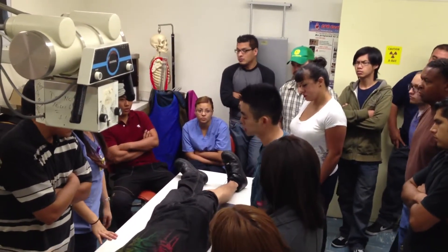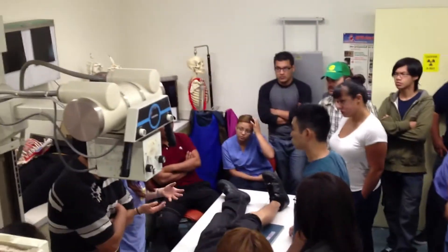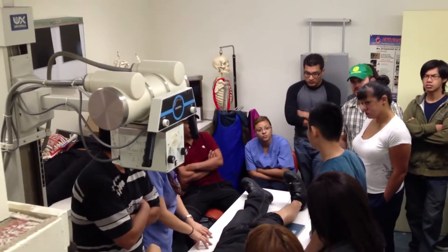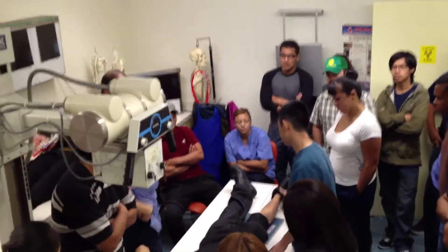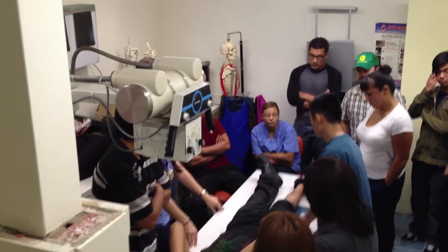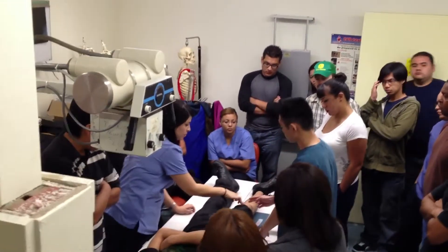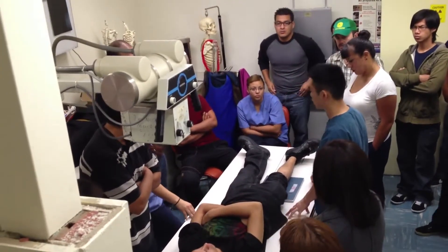Sometimes you put a sponge right here for uncomfortable patients — I haven't had a patient who couldn't hold it long enough to do the exposure. Then you tell them to relax and they go back down. You keep the same CR centering throughout the whole procedure — that's pretty much the same for the oblique. The lateral is a little more restricted.